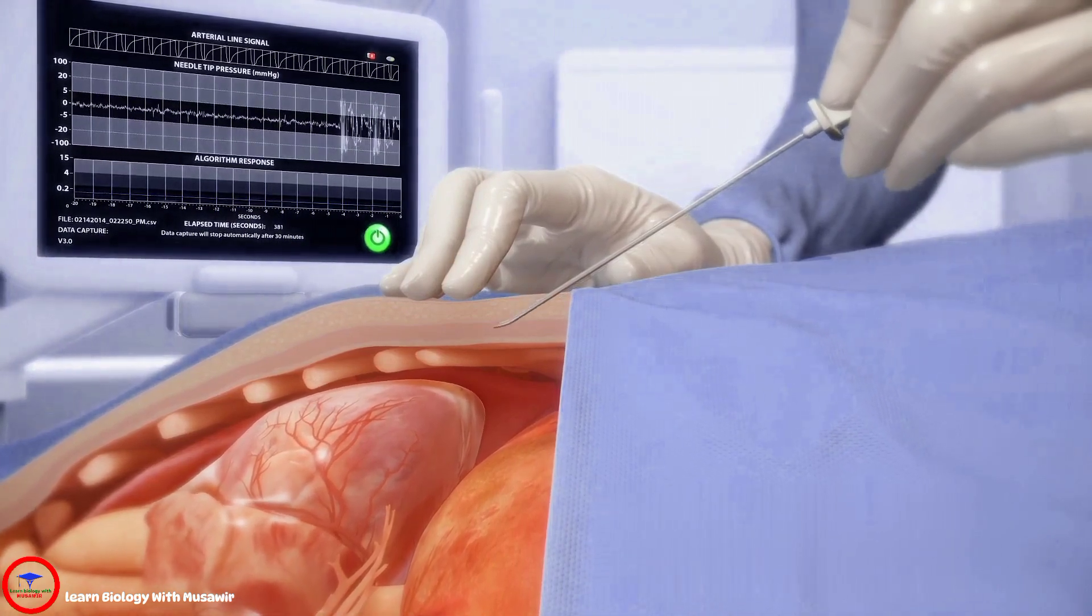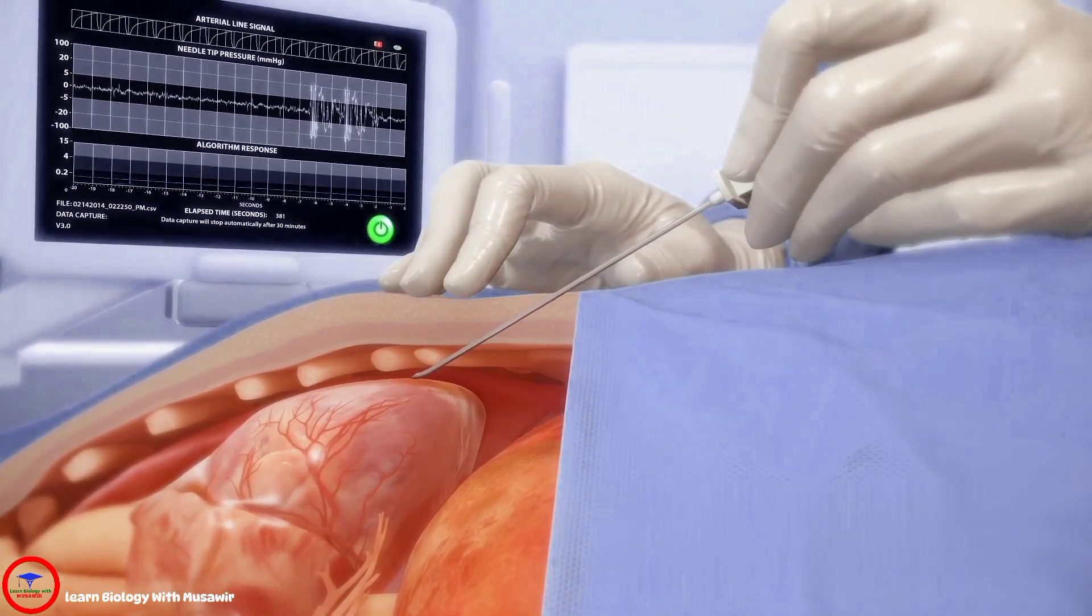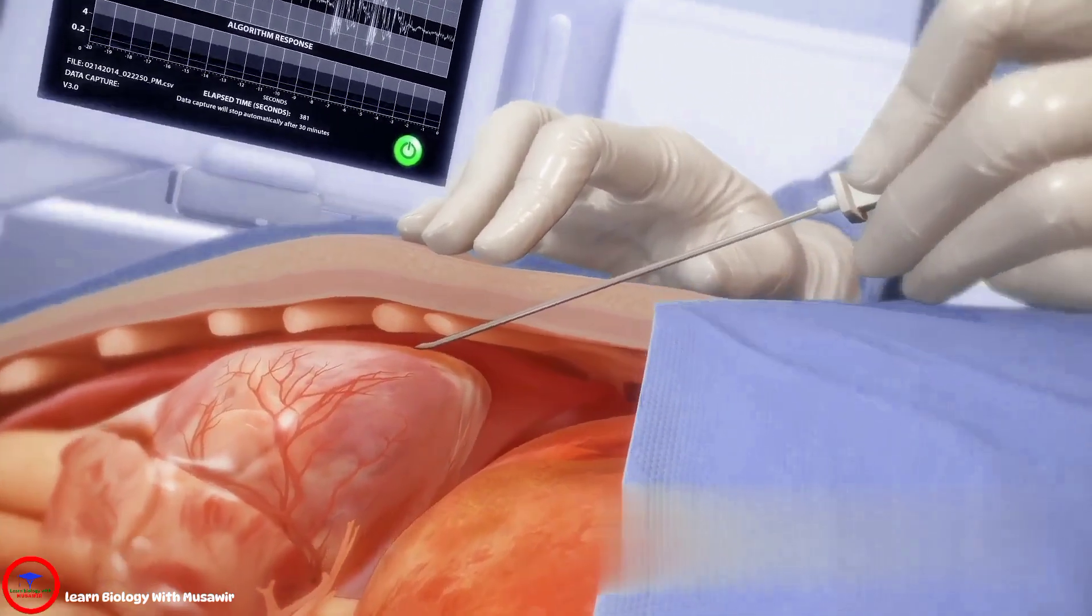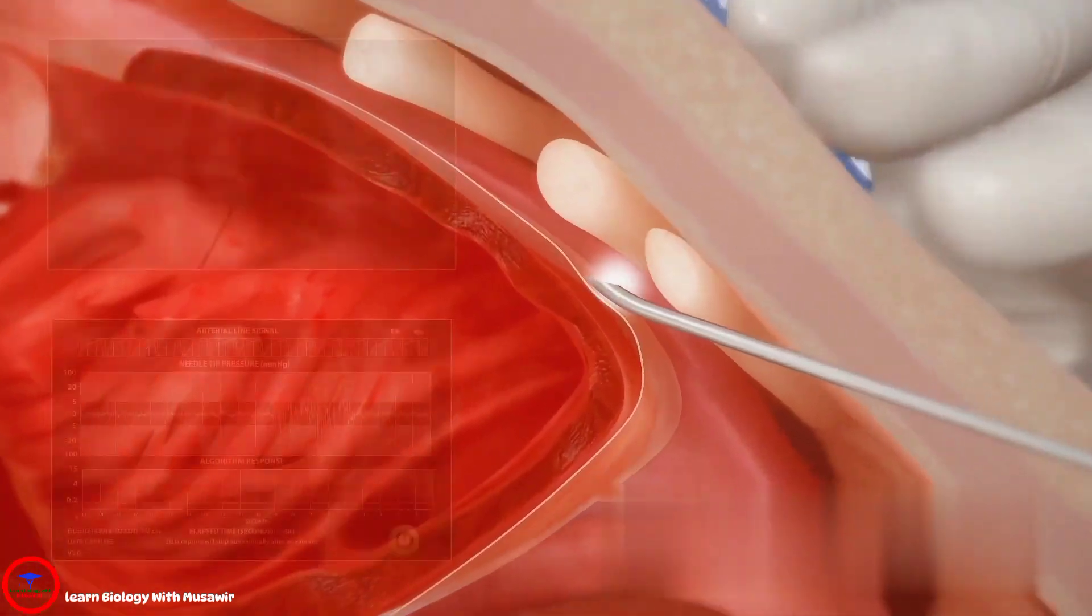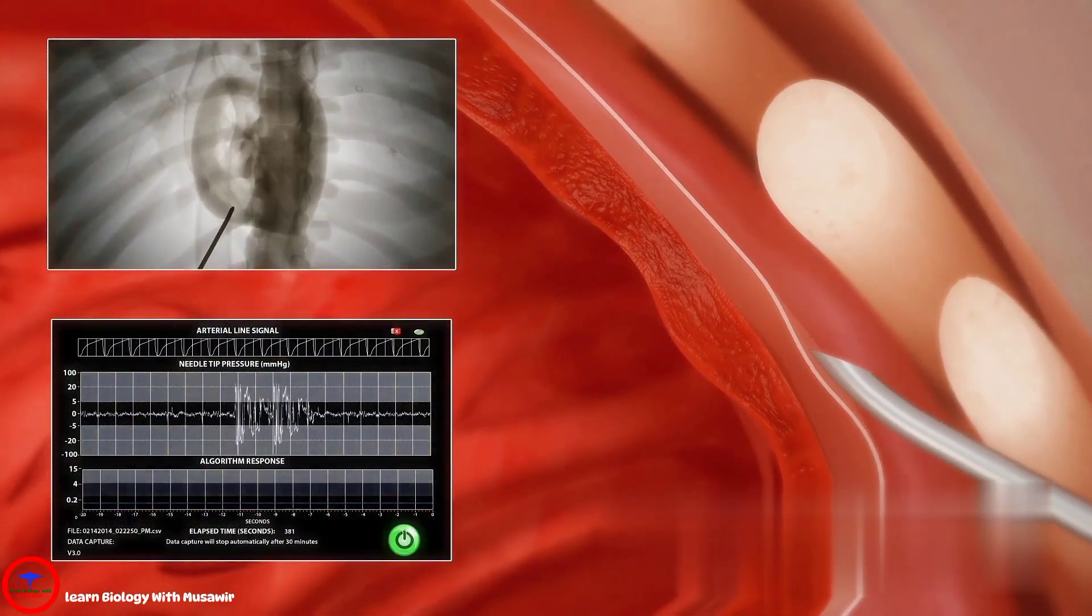The needle is advanced to the target site and needle tip location is indicated by an amplitude change on the monitor. A contrast puff under fluoroscopy shows tenting of the pericardial sac prior to insertion.